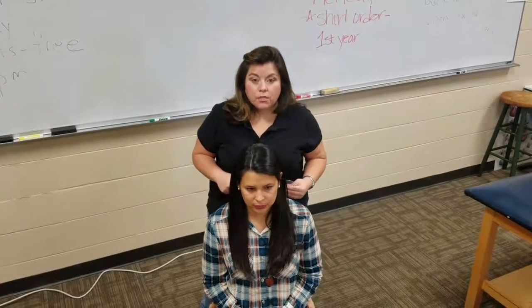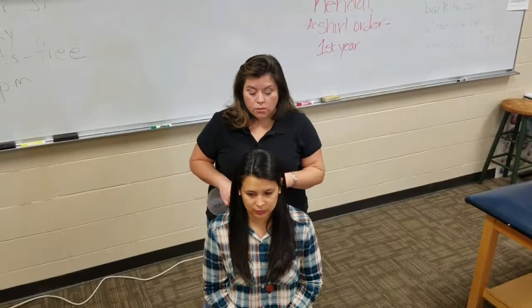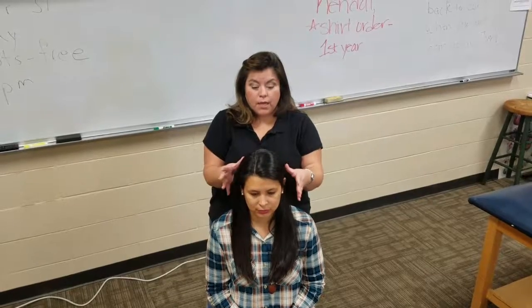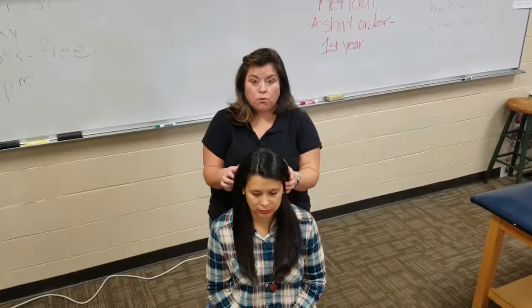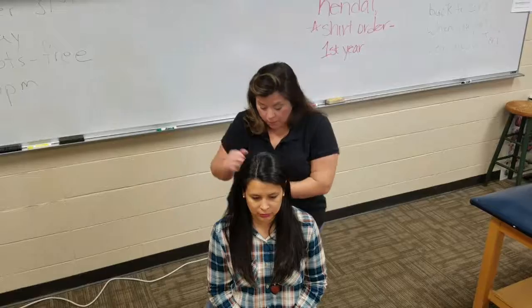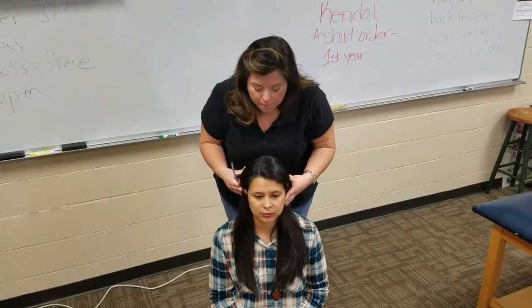All right, so the next one and the last one we're going to do is for cervical rotation. What we do is we have the patient sitting in a chair, looking straight ahead, and move them through the range of cervical left rotation, cervical right rotation. And let me get up on a stool so I can have a better vantage.